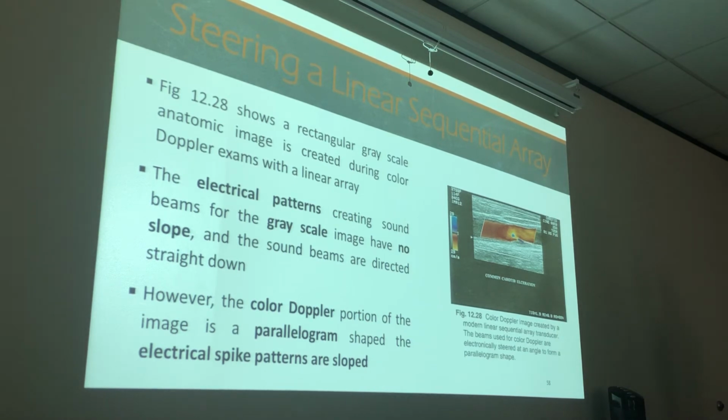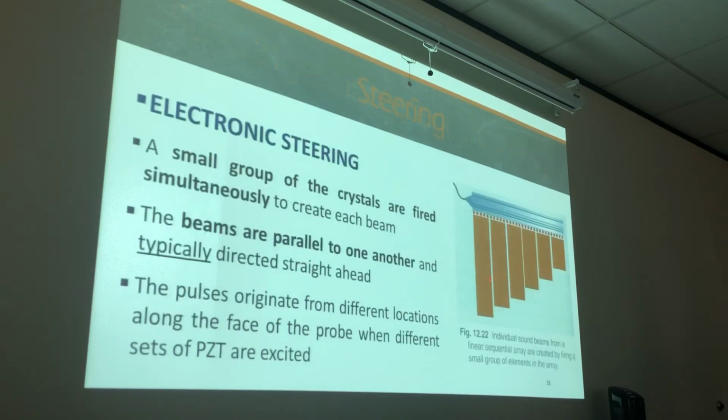Okay. What makes electronic focusing? It's not a beam. That's true. But how are the elements being struck with electronic focusing? By curved excitation pattern. So if they make a U like this, that means that it's going to create focusing. So this beam right here, it's neat. That's why these beams are coming out like this.